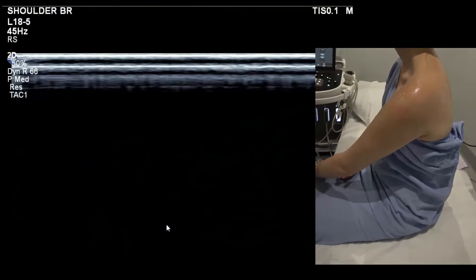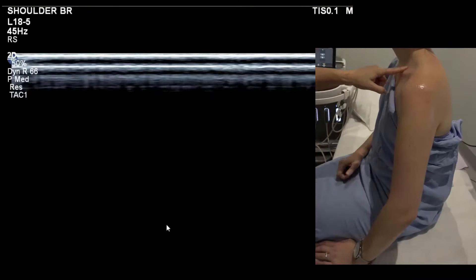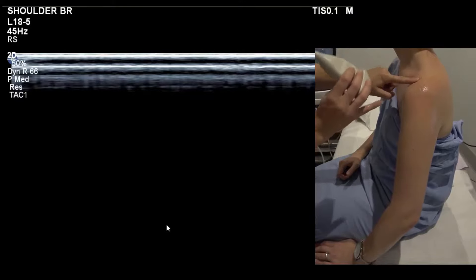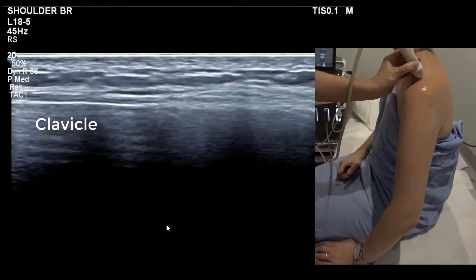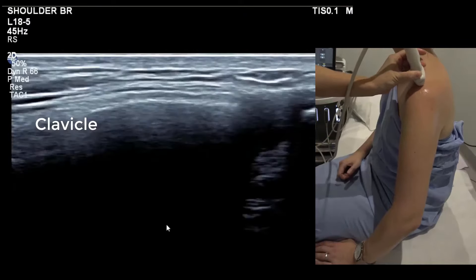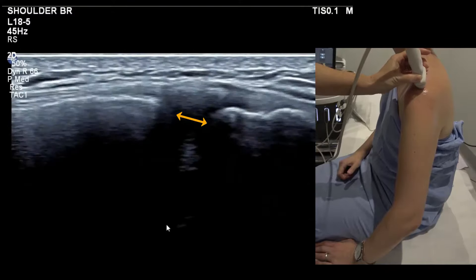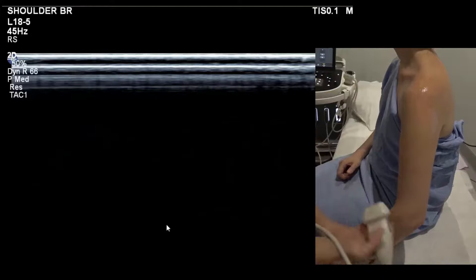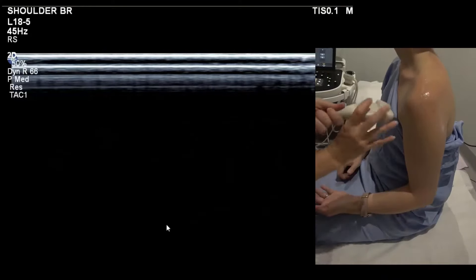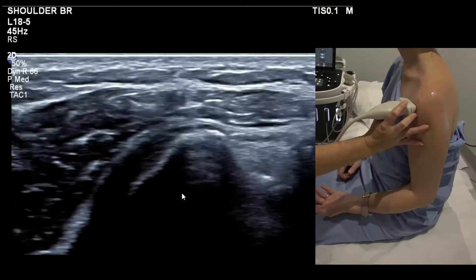The final step with the 18-5 probe is to look at the AC joint. Line up with the collarbone — you can feel the joint there. Put the camera in alignment with the collarbone — that's the AC joint — and scan from back to front.